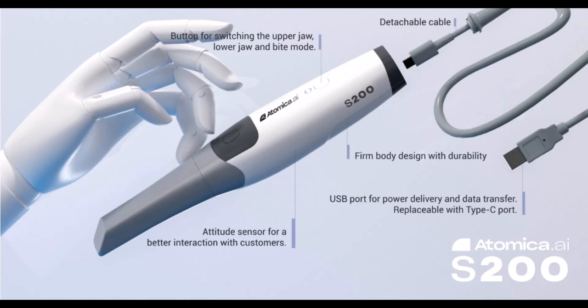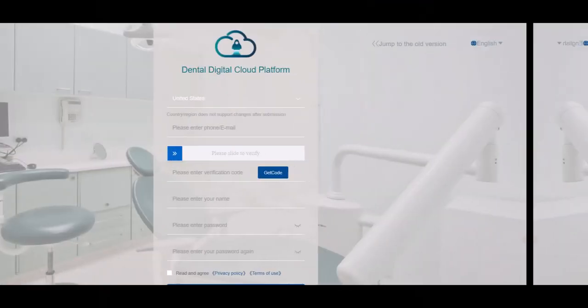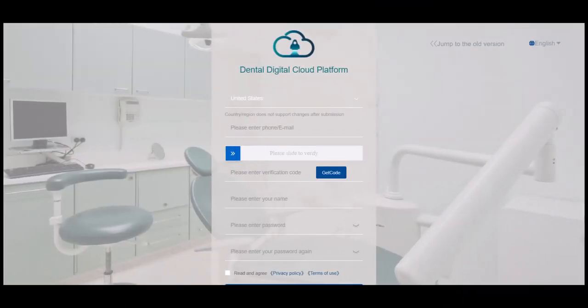Once you connect the scanner to the laptop, it's automatically connected with no need for further calibration. Now let's head to the scanner software. Once you install the software, you can sign up to the digital oral data management platform, where all your data can be saved on a cloud base.